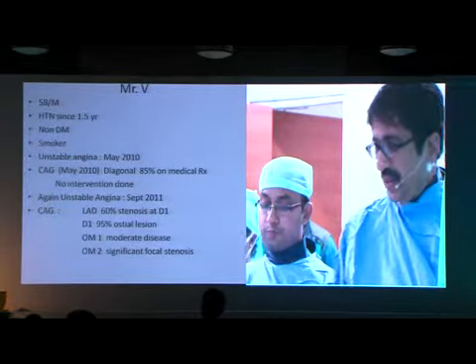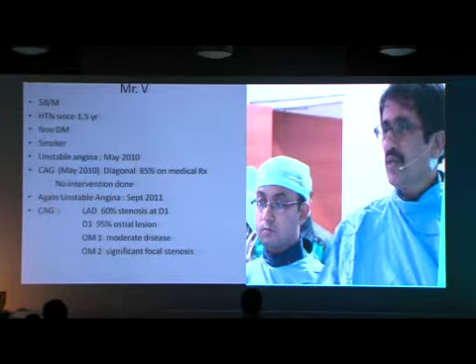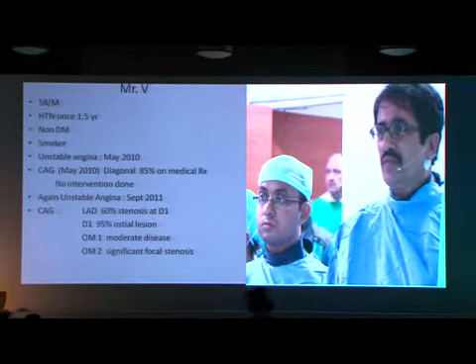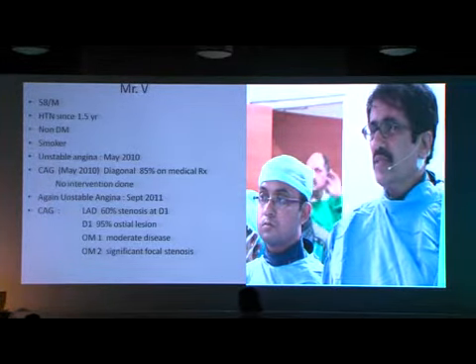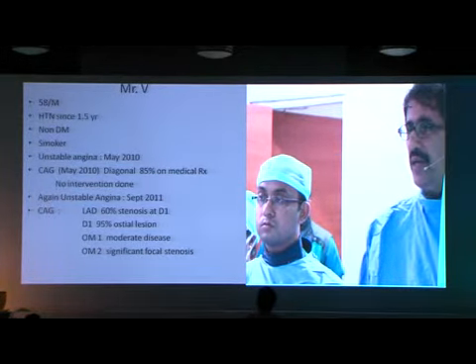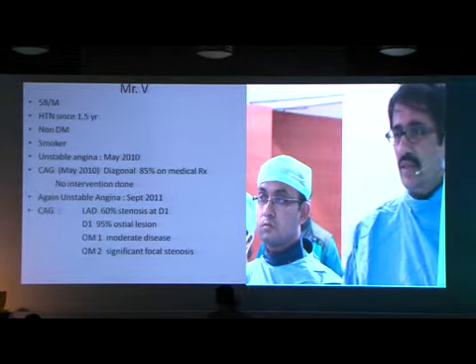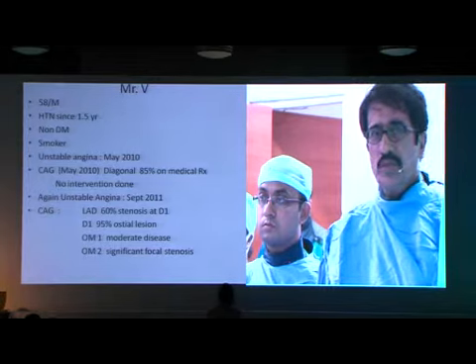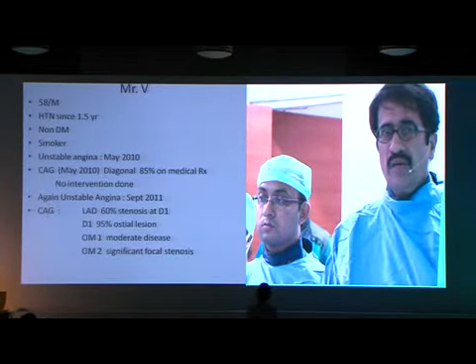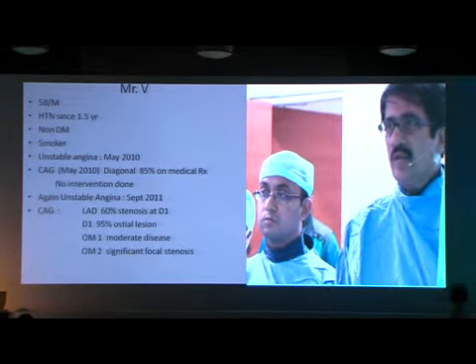So what we have here is a LAD diagonal bifurcation, and you can see for yourself critical stenosis in the diagonal margin. Let me give you a little story. Can we have the slide? This gentleman was angioed in early 2010 for effort angina and positive stress tests, and the diagonal lesion was rated around 80-85%.